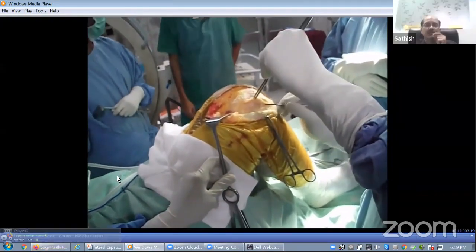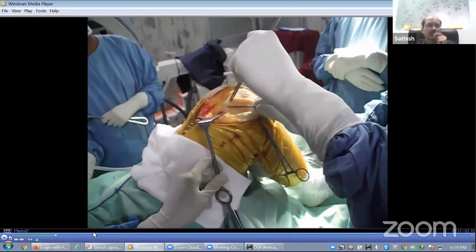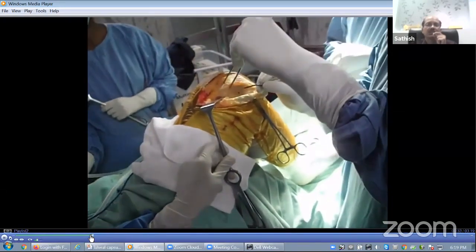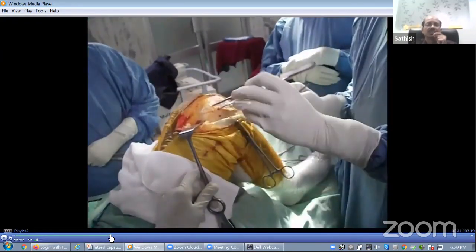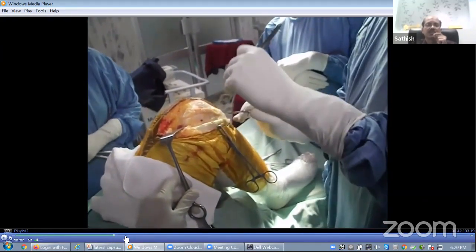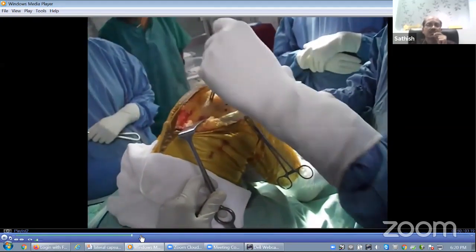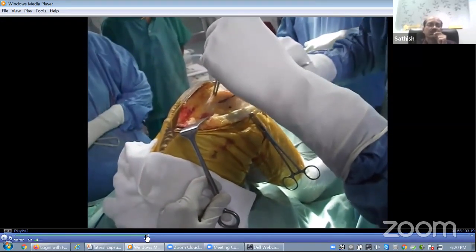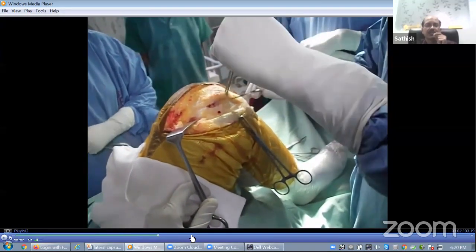So this is the head end, and this is the foot end. You can see the foot. So the anatomic dissection is done, and you can see on the deeper side, the joint is open close to the lateral margin of the patella. Now the joint is getting opened on the innermost side. The joint is open now. So we have got the anterior flap which is in continuity with the anterior aspect of the patella.